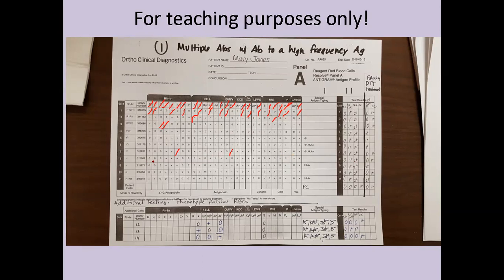So we've gotten rid of most of the RH ones. Nothing we can do there. Can't get rid of JKA. Can get rid of LEA. Big S. No. No, okay. Can't use cell 9 because that one reacted, and it looks like we can use cell 10, and that'll be the last cell that we can use.